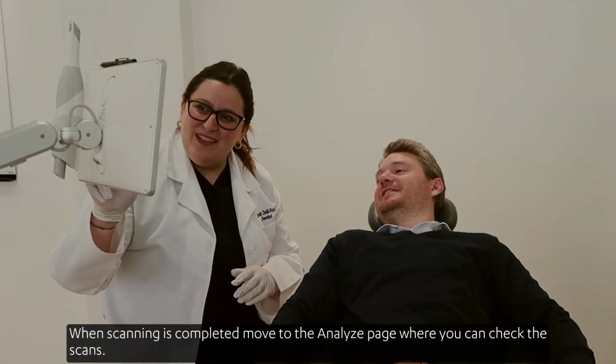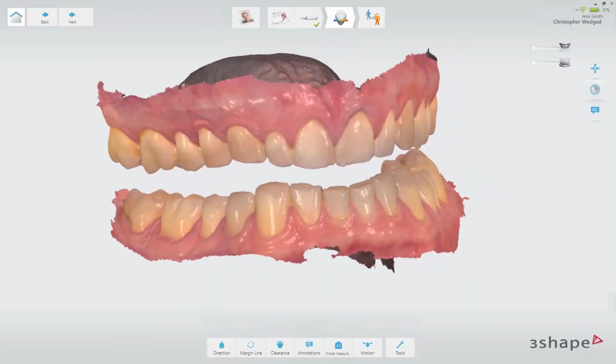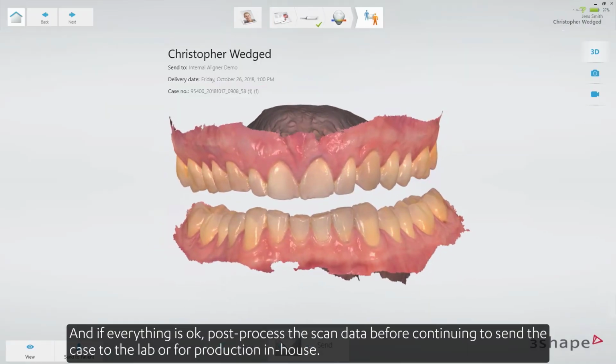When scanning is completed, move to the Analyze page, where you can check the scans. And if everything is OK, post-process the scan data before continuing to send the case to the lab or for production in-house.